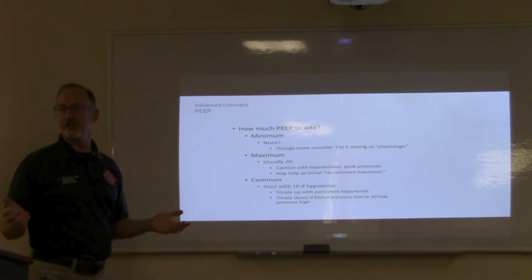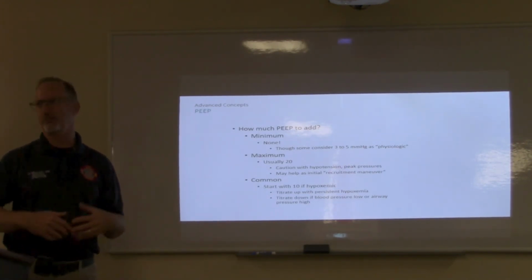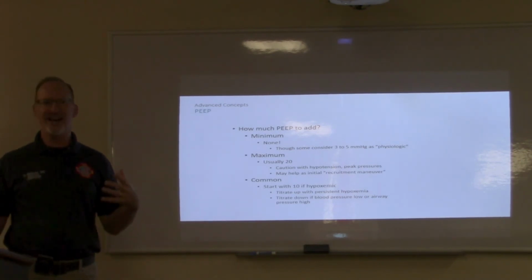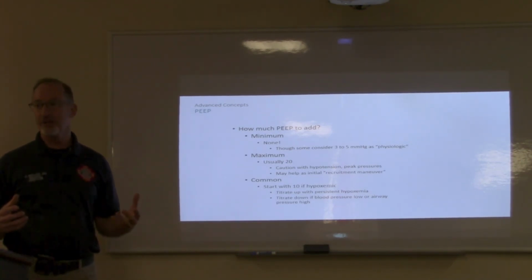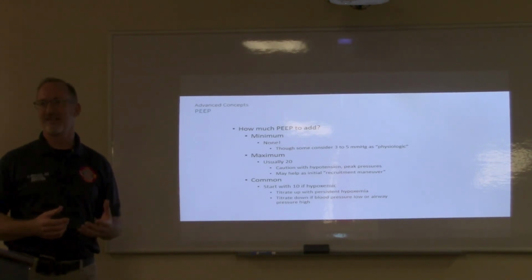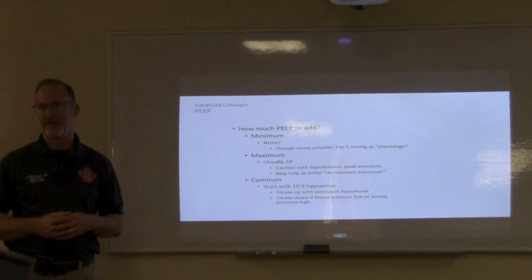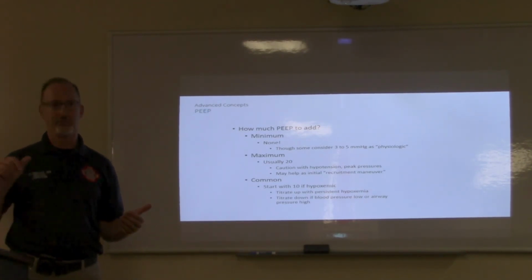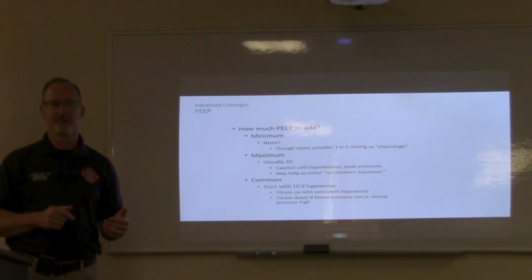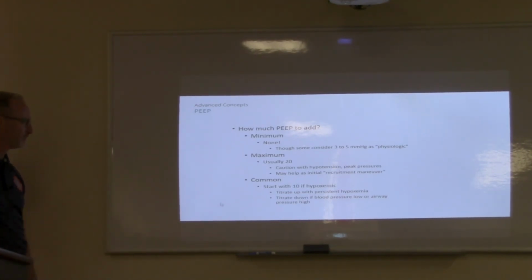Once you get ROSC on somebody, let's say it was a classic overdose, they probably aspirated, they've got a lot of atelectasis from being down and kind of apneic for a while, but now their SAT's in the 70s or 80s, despite the fact that you're giving them 100% oxygen. That's a patient where, unless their blood pressure is in the toilet, let's go up on the PEEP. And you'll see their SAT, in most cases, will come up in a few minutes with the PEEP.